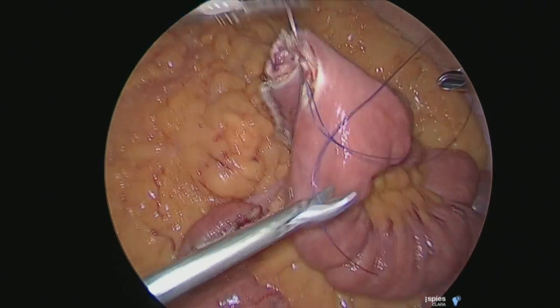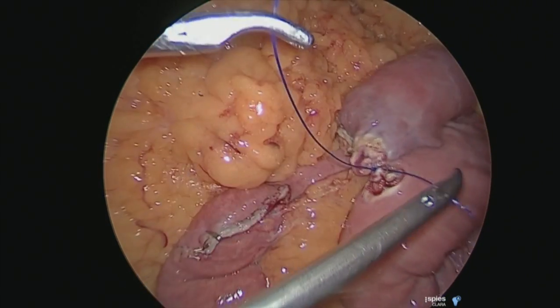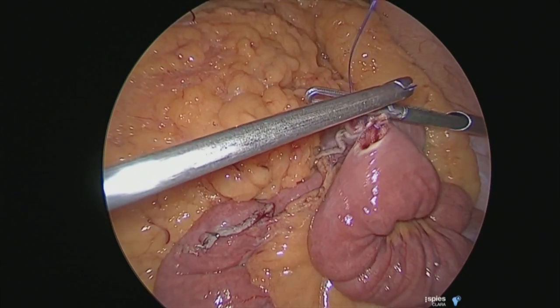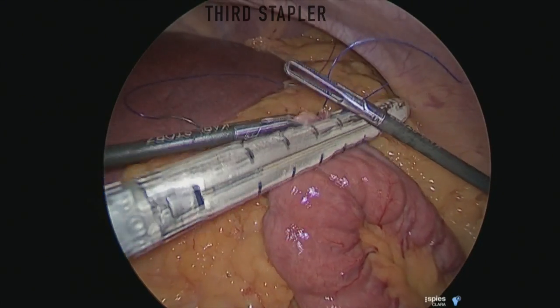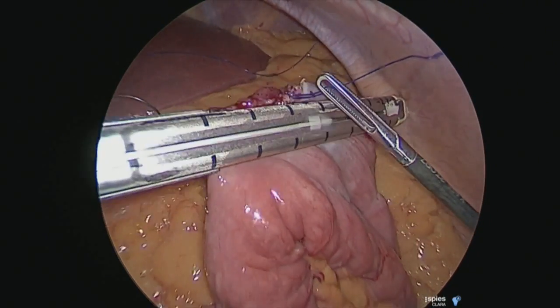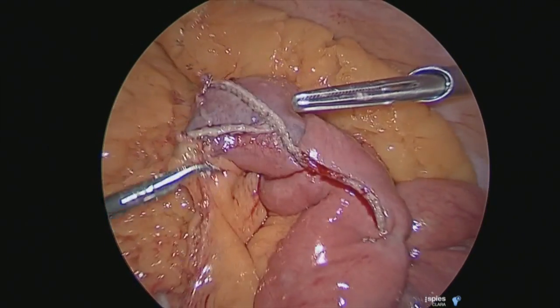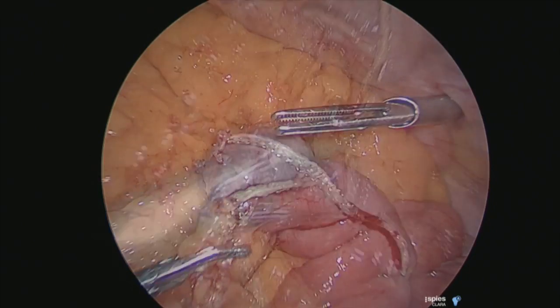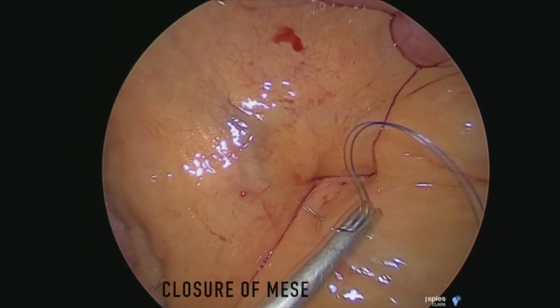In the three stapler technique, you then take a stay suture just to hold up the cut edges. Your assistant holds it up and then you apply the stapler, making sure that the limb is not obstructed so that there is no obstruction to the distal flow of the ingested material. You look for any bleeding and you can either suture it or apply clips.